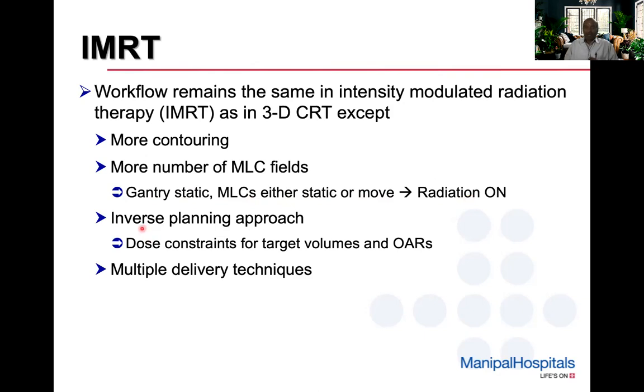And the most important difference is that we use an inverse planning approach. Instead of placing the fields and calculating the dose, how the fields are to be intensity modulated is reverse calculated, in order to meet the dose constraints we define for the target volumes and the organs at risk. There are multiple delivery techniques that are commercially available for delivering such intensity modulation.